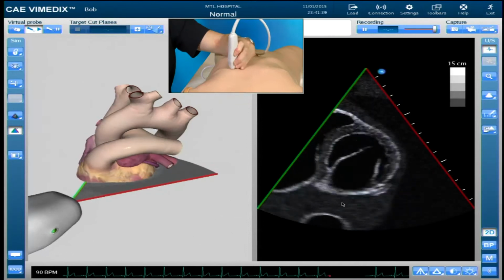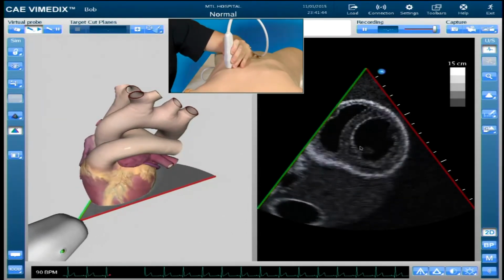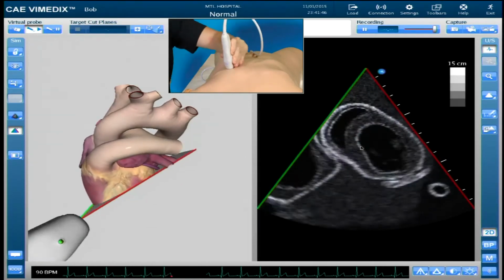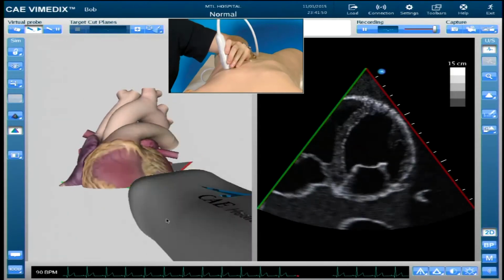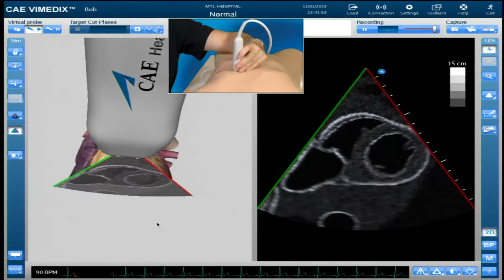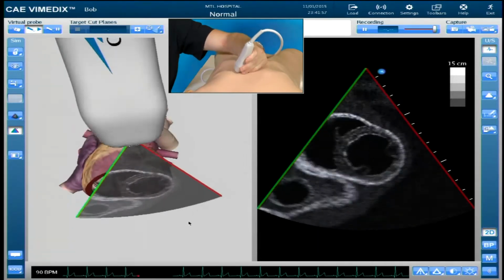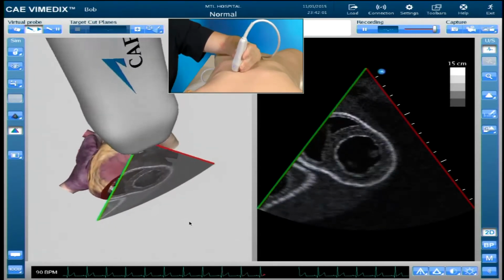So what you want to be seeing is it bisected so it's absolutely perfectly spherical. So either you need to rotate it till you start to see that perfect circle, or you need to look at trying to move up or down the axis of the heart.